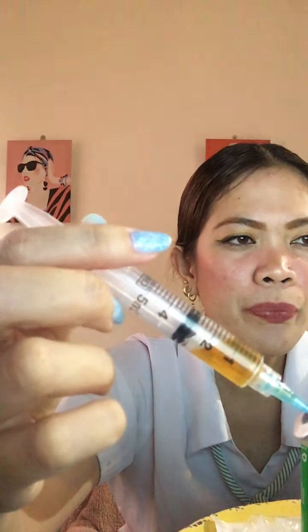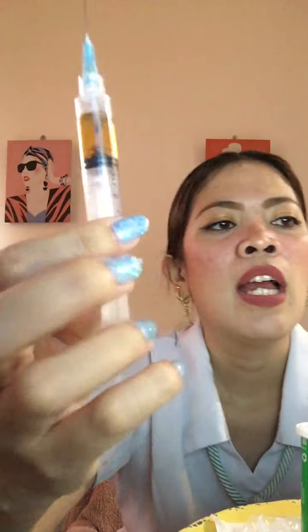Now, so we've just withdrawn, let's say, 3 ml of medication from the ampule.